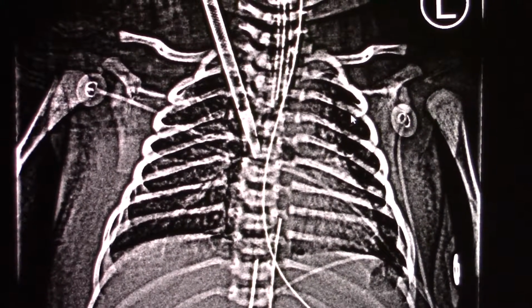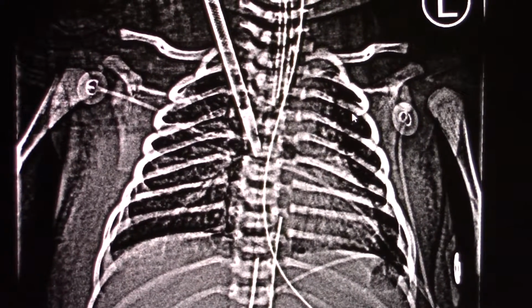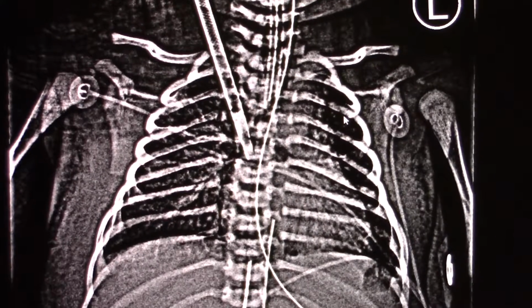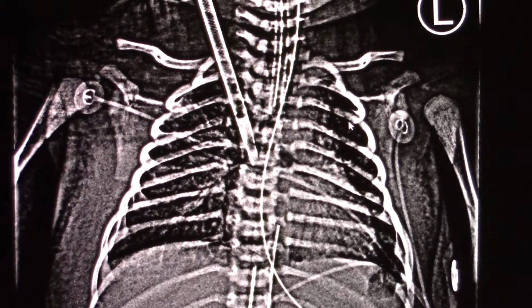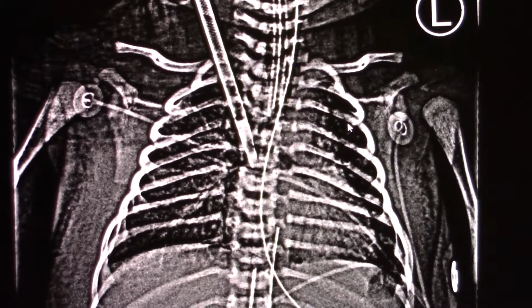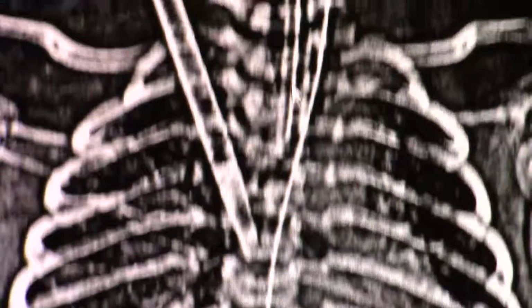So when we move the head to the right or the left, we know that's going to pull the tube up from the neutral position. When the chin is down, it's going to push the tube in from the neutral position. And when the head is pulled up off the chest, it's going to pull that tube up from the neutral position.